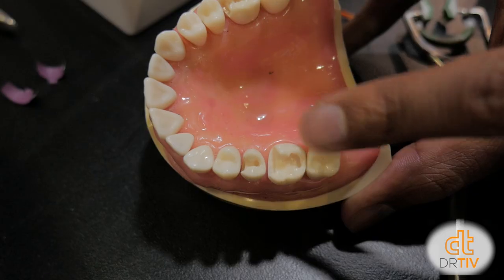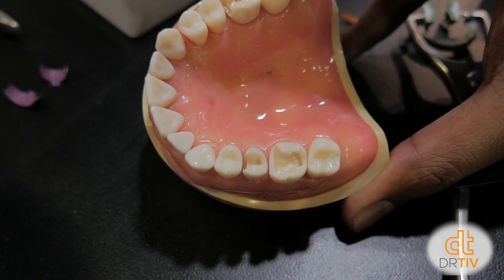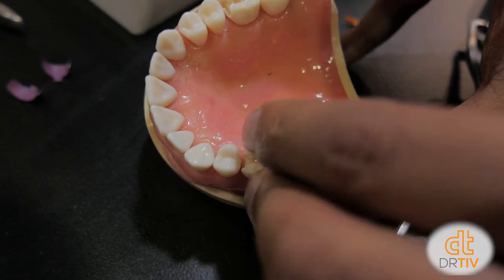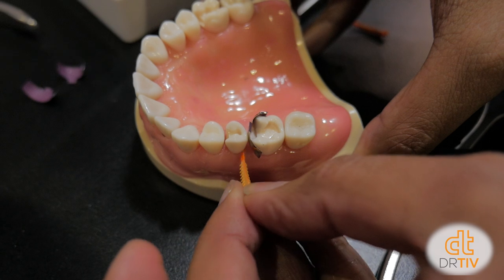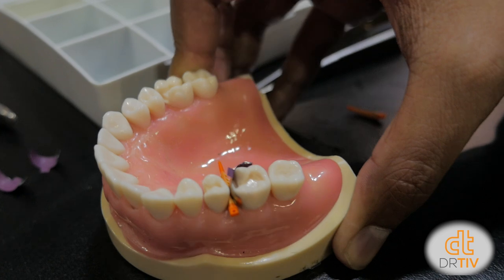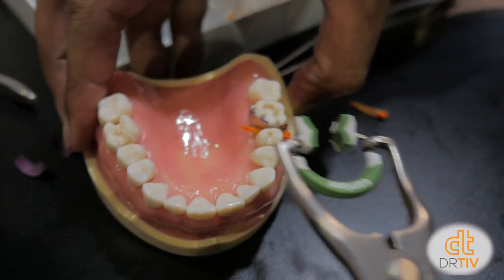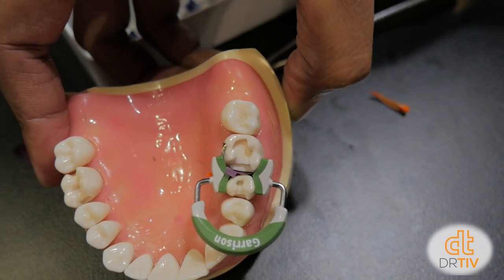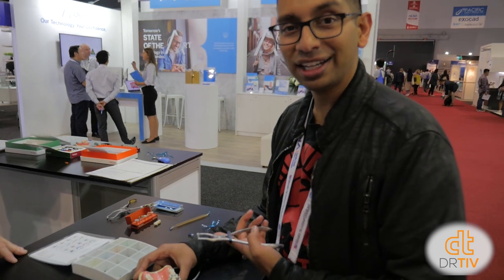Let me show you in action. As you can see, a lot of these restorations where you've lost a cusp, it's really hard to get a smaller sectional matrix band on there. But with this, let's put our band on. We've got our wedge — gently place with extreme care. Then we take the Garrison and place it in, just like that. You can see it's holding onto the cusp, not squeezing in. We can restore it. I need one of these. Garrison is sold by Henry Schein and Erskine.